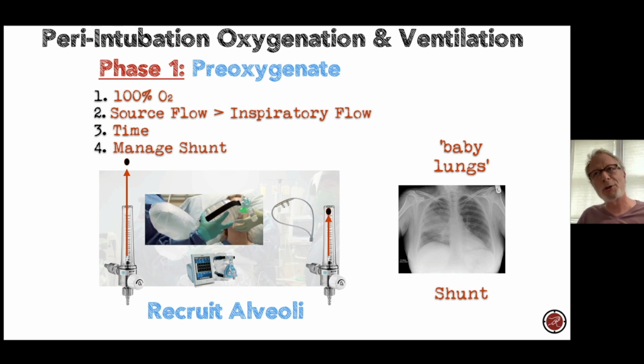Sometimes you need to do pressure support and give them inspiratory support. That combination of inspiratory support plus PEEP is BiPAP. If you're doing just PEEP, it's essentially CPAP. And these patients, again, are spontaneously breathing. And you can do it two ways.